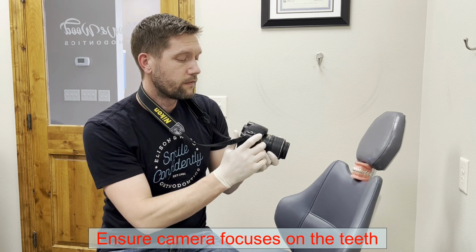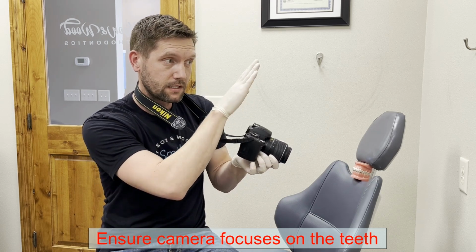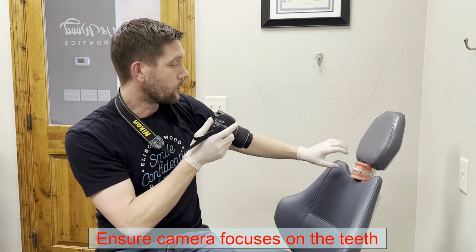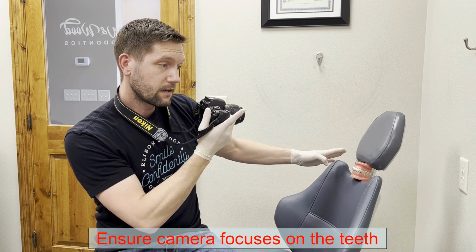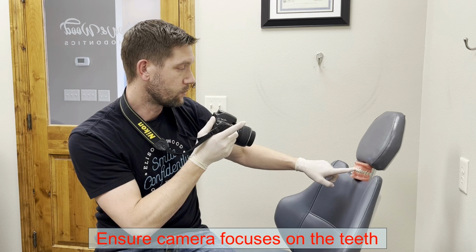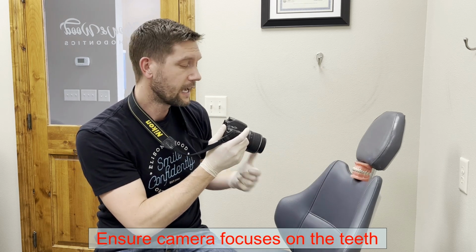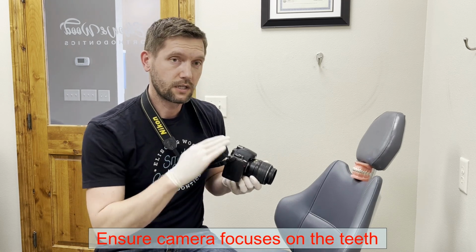Now, whatever you focus on, one of those boxes is going to light up. Whatever thing it was over when it lit up, that's what's in focus. So if it lights up over the cheek or the lip, then you want to take your finger off and refocus until it will light up over the teeth. That means that the teeth are now in focus, and then you take the shot. If you get those two things right, your shots will always be in focus.